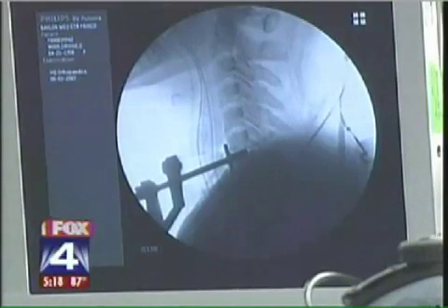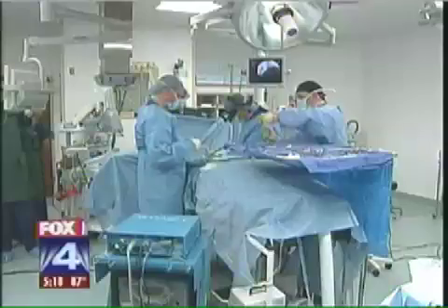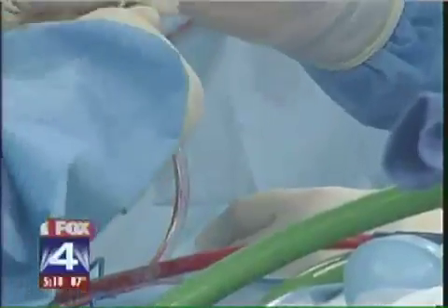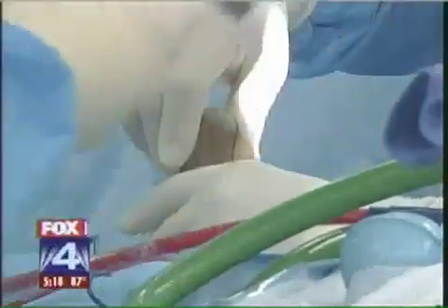That pain in the neck and/or down the arm gets so bad for so many people that 250,000 times a year, doctors go in and surgically extract the damaged disc and fuse the surrounding spinal connections together. This fusion surgery has been used for years, but not without concern.